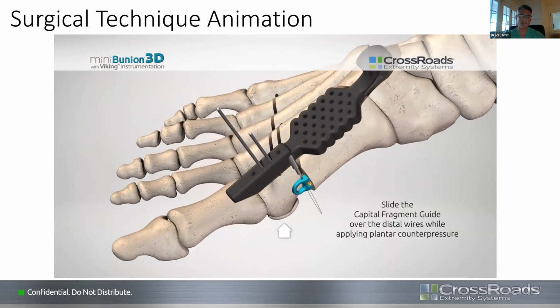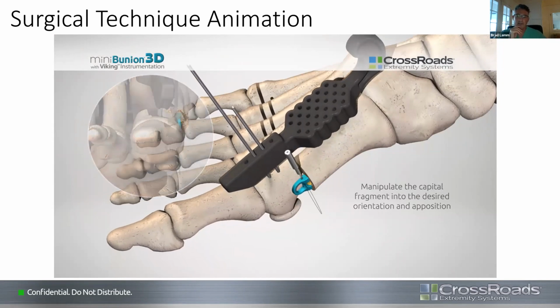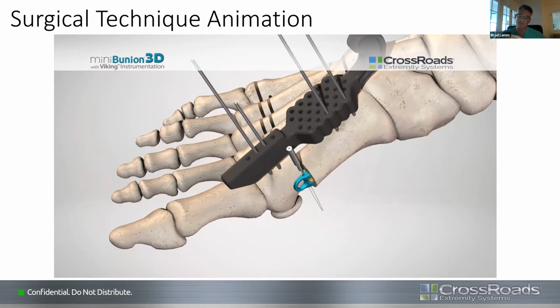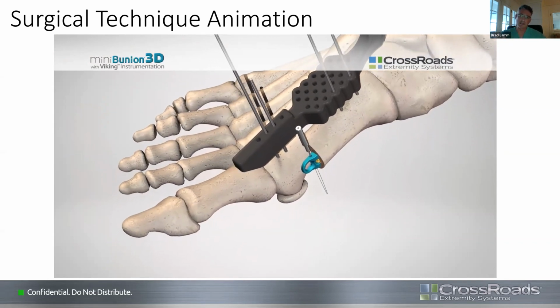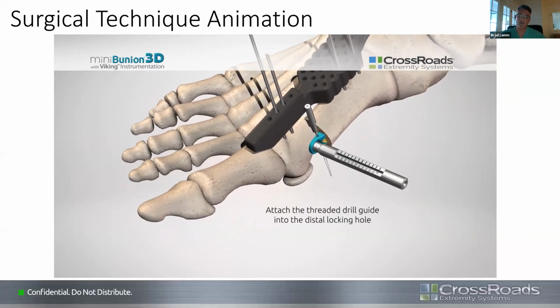Then you put your Viking device back on, and this is made easy where you can rotate to get your frontal plane alignment. I find not so much rotation is needed like a Lapidus, just a few degrees. And you can use that handle to compress a little bit to make sure your osteotomy is where you want it.